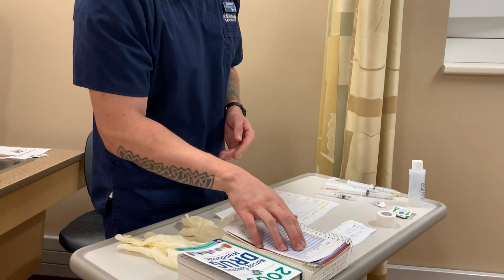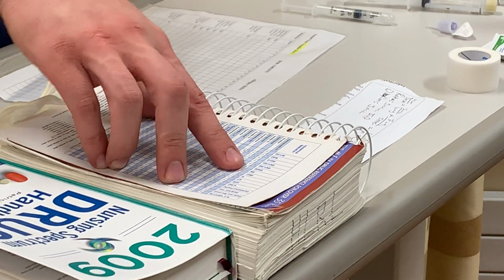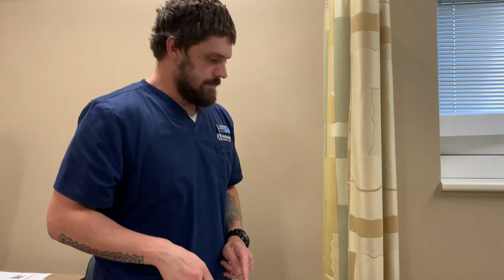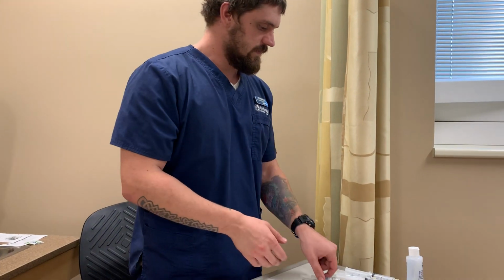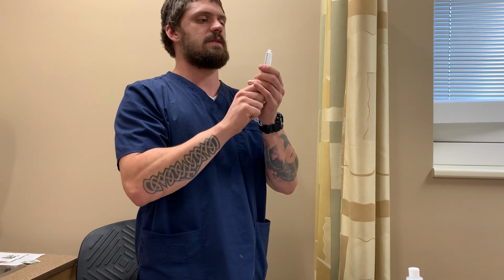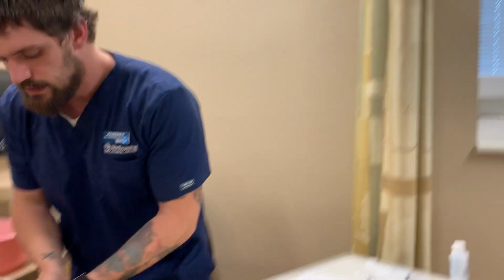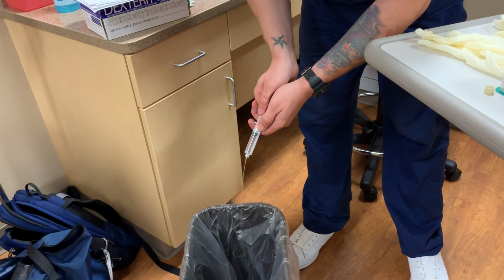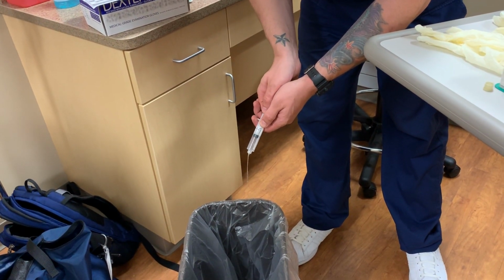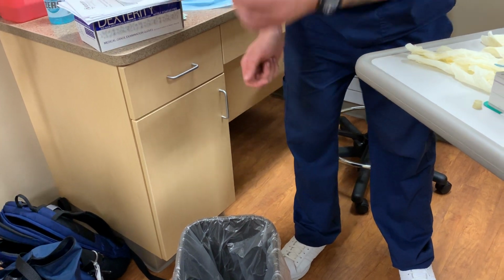We have checked our compatibility in our compatibility book, which morphine is compatible with all of these listed, but we are using normal saline, and it is also compatible. So we will take our sterile IV flush here and get the air bubbles out. And we will dilute this in 5 milliliters. And you can do more, but we don't want to do less. So I'm going to get 5 milliliters.